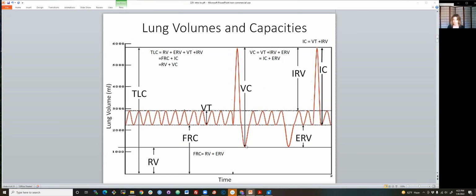So we encourage them to exhale fast and hard and continue that exhalation until they feel like they can exhale no more. Once they feel like they can't exhale anymore, they will take a deep breath in or a regular breath in. It really depends on the person at that point or how you coach them. And the machine will recognize also when the flow has ceased and tell us that. You might have to repeat this maneuver a few times to get measurements that are repeatable.